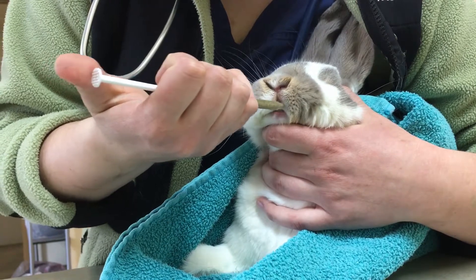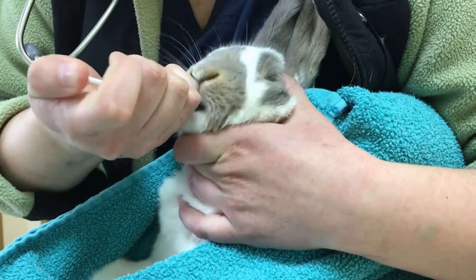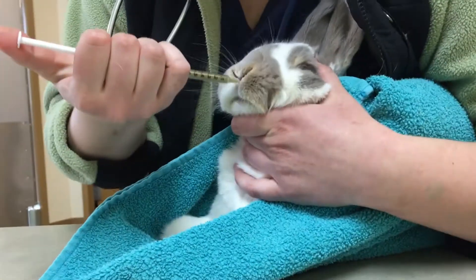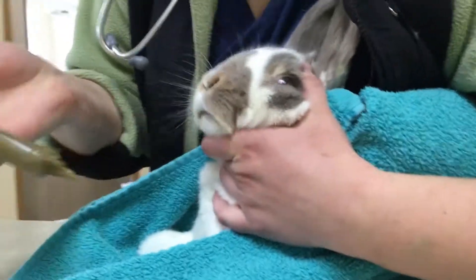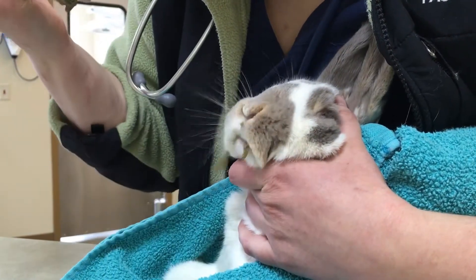So go like that, there you go. And she'll start chewing because she's like, what is this? And I'll start. Here we go. You can follow it up with a larger syringe if she'll let you.